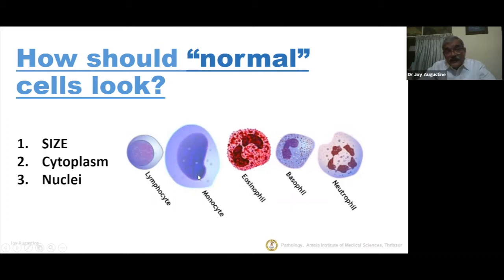So the figure-of-8 or the kidney shape is not always a rule. Next, the cells with the cytoplasm which you look at. The eosinophils stand out because of their orangeophilic granules, basophils with the basophilic granules, and the neutrophils may not show the granules properly but will have a violetish tinge. Of course, the neutrophils will be multilobulated.